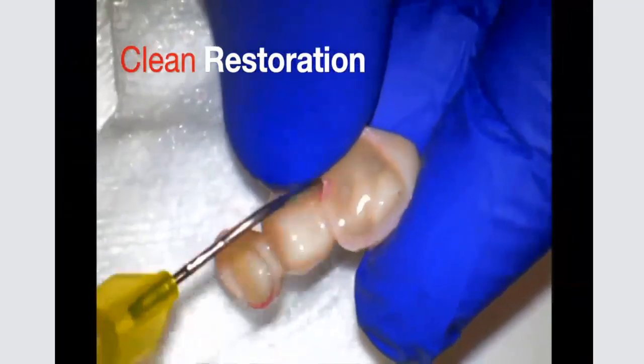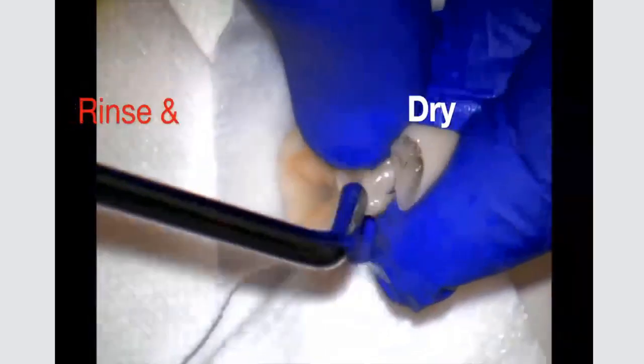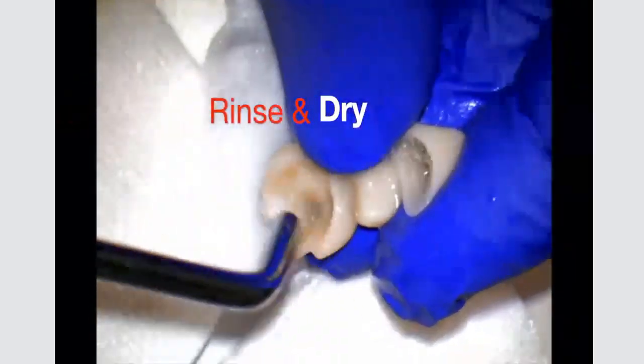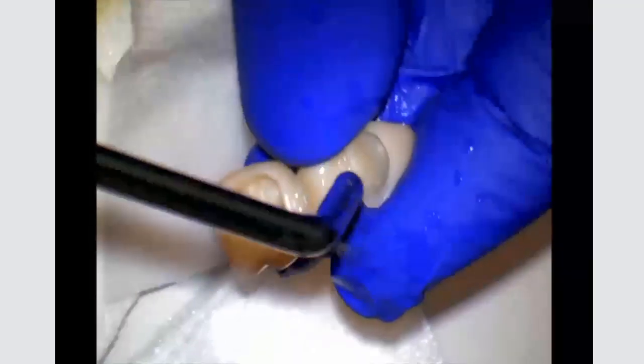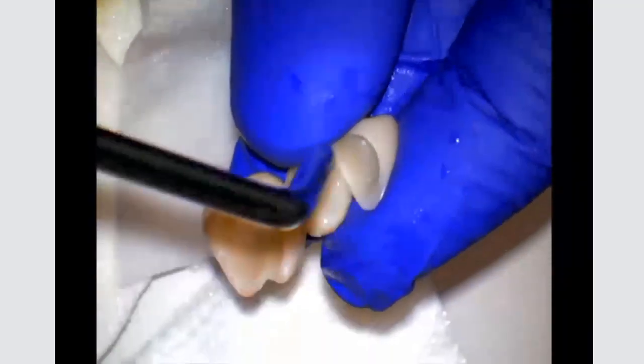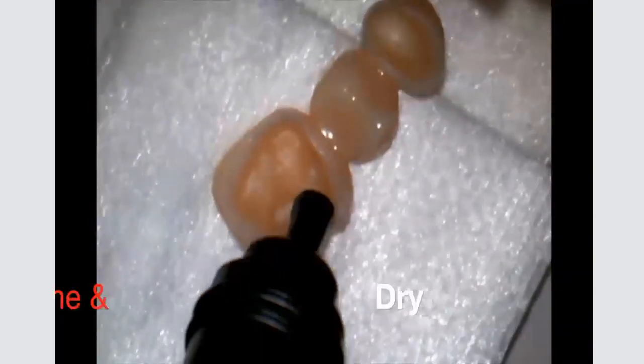Then I'm going to clean the inside of the restoration with, I use a bleach. Then I'm going to rinse it out really well and dry it. Now it's all clean. And I could have sandblasted this as well, very easy, or use IvoClean.